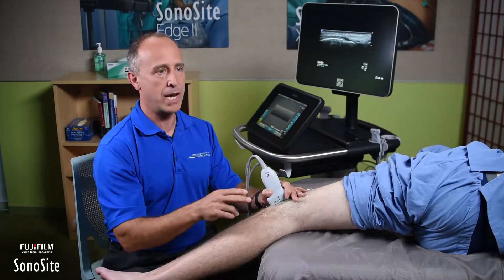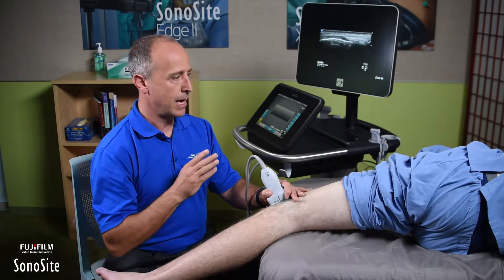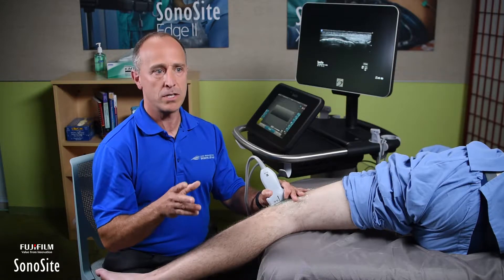I can be looking straight ahead, touching and adjusting the screen right in front of me, and have the patient in a comfortable position. Spend the time to work on your setup ahead of time so that you're in a comfortable position, because if you're uncomfortable, it's going to be really hard to get your scanning done well.